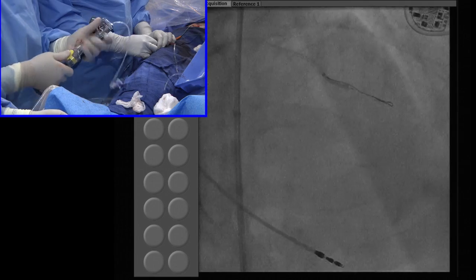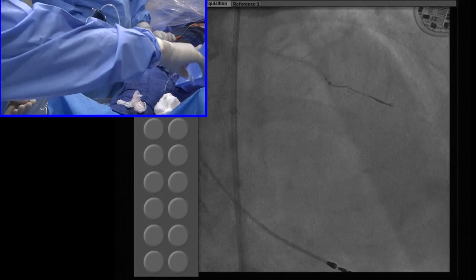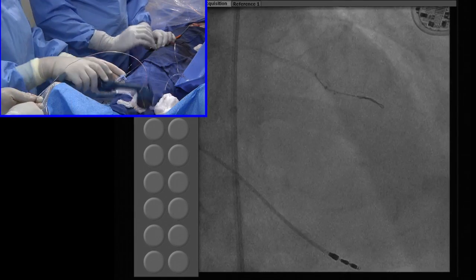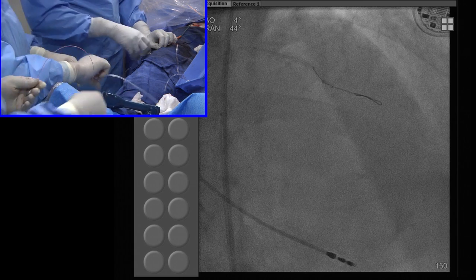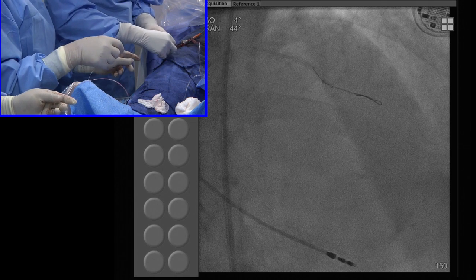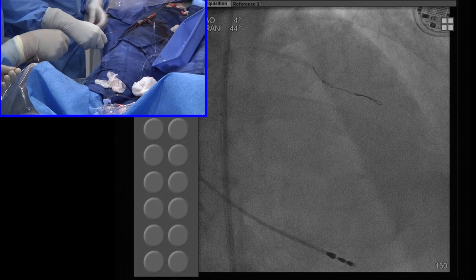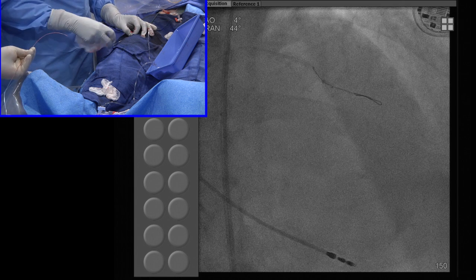Okay, I'm taking it out. So this is a non-compliant balloon you have there? Yeah. I went to just the newer balloon, and then see, as the balloon is deflating, I'm advancing the guideliner. So we got sucked in more. It must come out. But now you have to advance the wire. Right now, don't touch anything. Get your stent there. Don't pull. Okay, get me the stent.